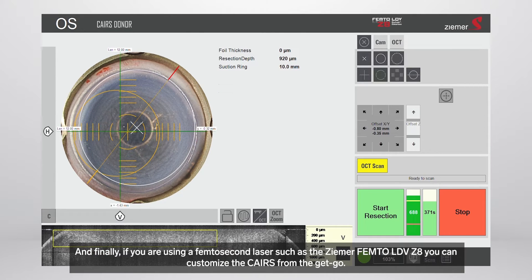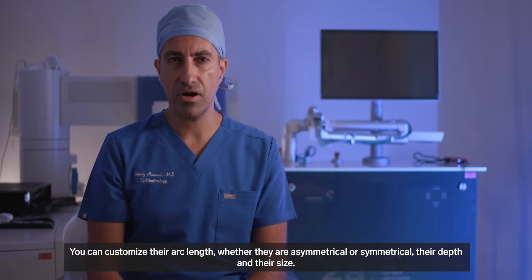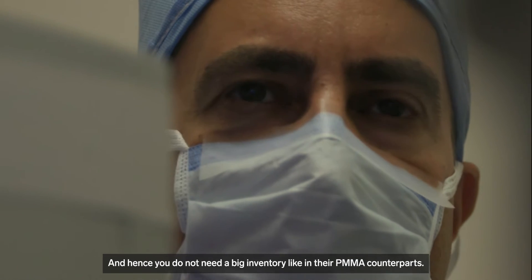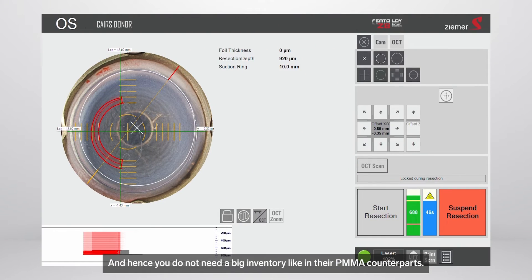Finally, if you're using a femtosecond laser such as the Ziemer FEMTO LDV Z8, you can customize the CAIRS from the get-go. You can customize their arc length, whether they're asymmetrical or symmetrical, their depth, and their size — and hence you don't need a big inventory like with their PMMA counterparts.